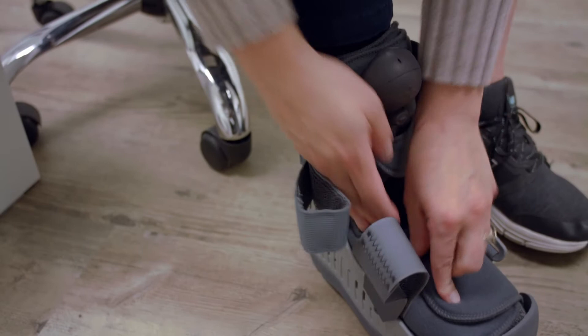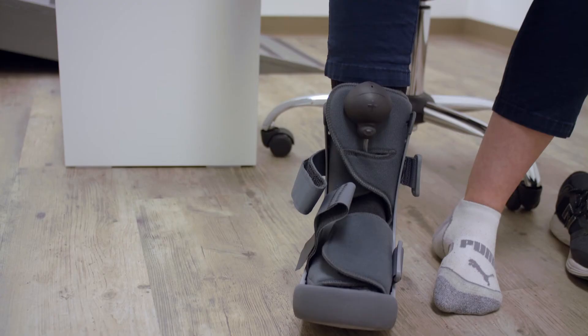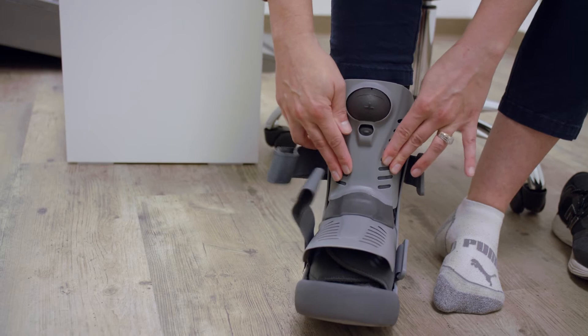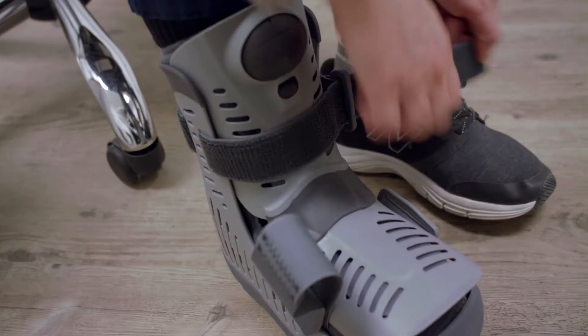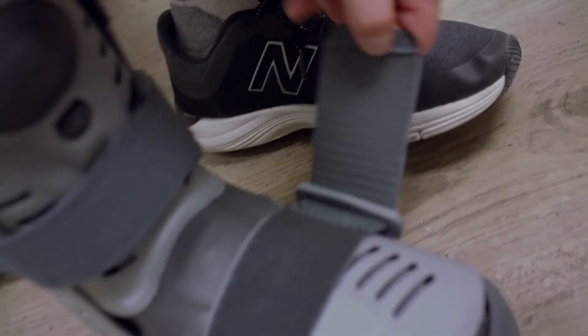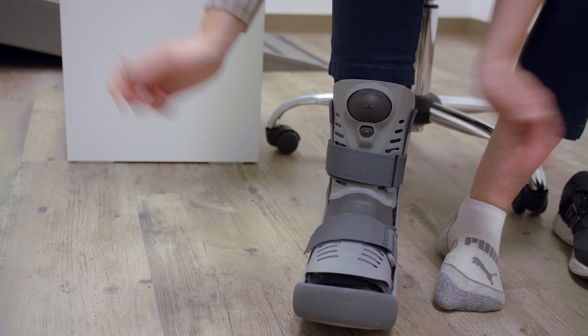Do it up, then take the cover and place it on — these two go inside. Snug it up. Do the ankle strap always first; it holds your heel to the back of the boot, so it's nice and snug.